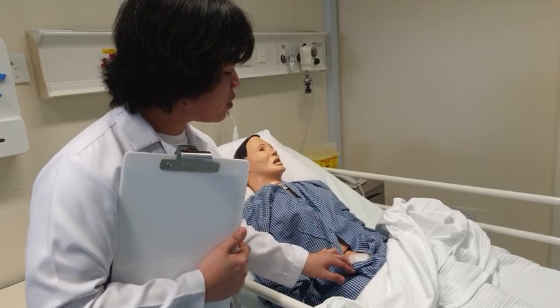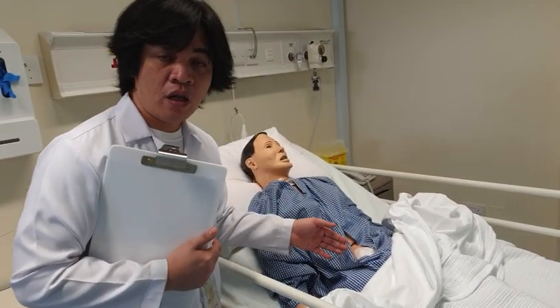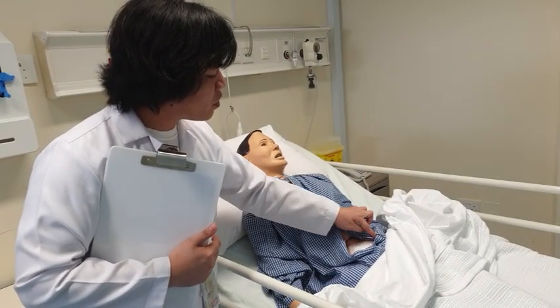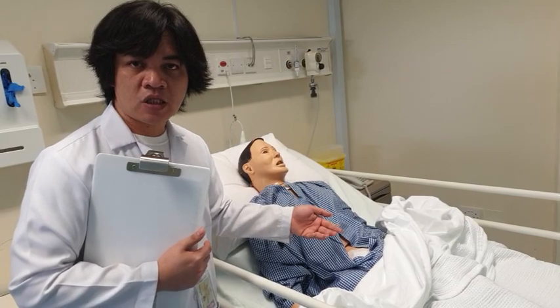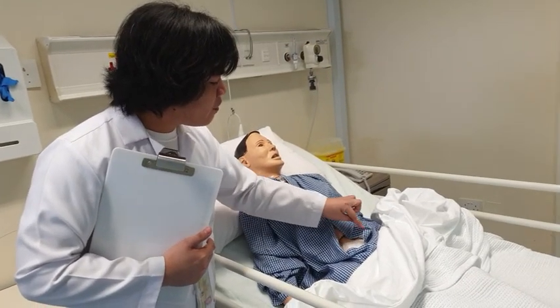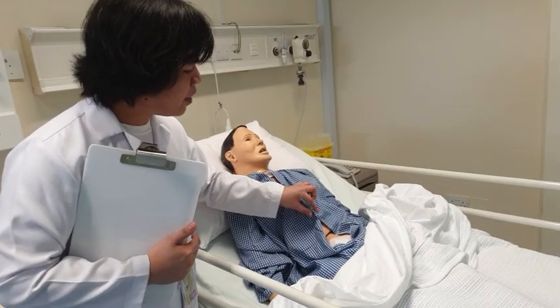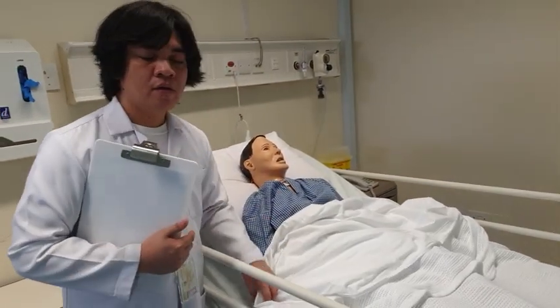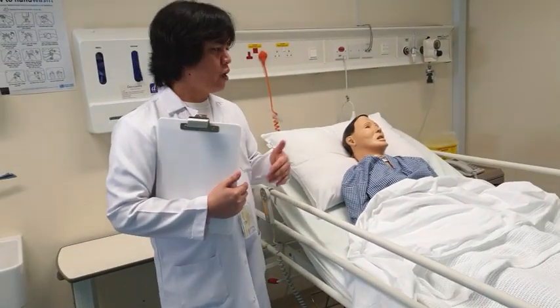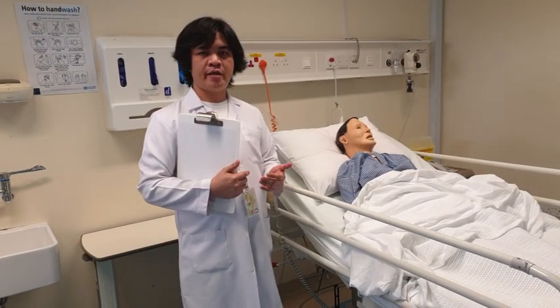I'm going to assess or check for the size of the wound. It seems that the wound is very small. I'm going to assess further. Check if there is bleeding. If the dressing is soaked with blood, check if the surrounding tissues are inflamed or swelling. And then you can close it back. Aside from that, you need to assess also for signs and symptoms of local and systemic infection.